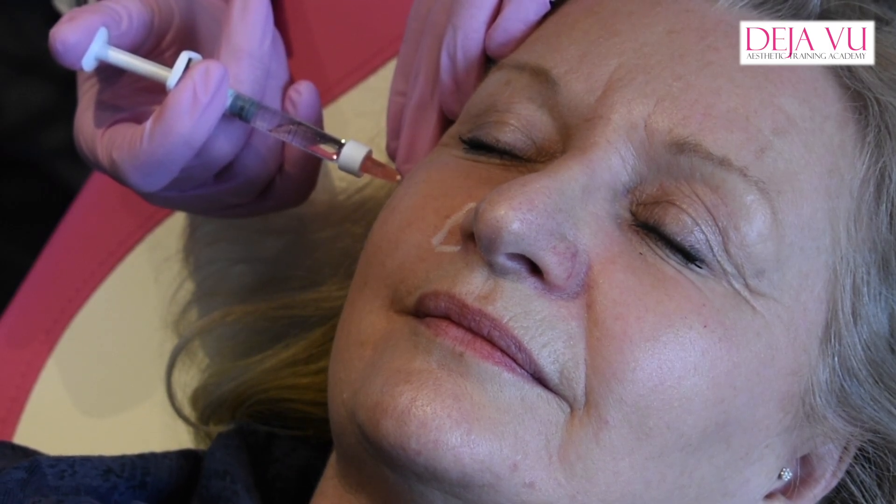I'm going to inject it very, very, very slowly. How much do you put in there? Again, it depends on the person. I want to use 0.5 either side, so I'll most probably do sort of like 0.2 to 0.5, doing two point injections.